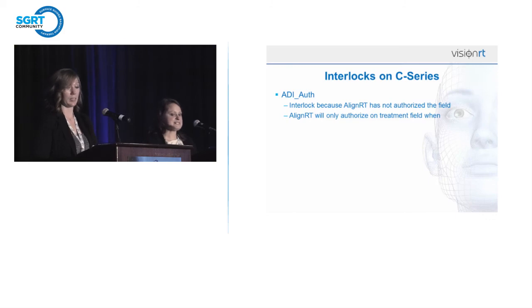Just like TrueBeam, C-Series has to be moded up. Now, when we say mode up on C-Series, we have mode up referred to twice: mode up on the 4D ITC screen, and then mode up on the key console. In our case, we're talking about the key console. You can mode up your patient, go in the room, and set them up so you can see all your parameters. It's not until you mode up the actual key console where this is going to happen.